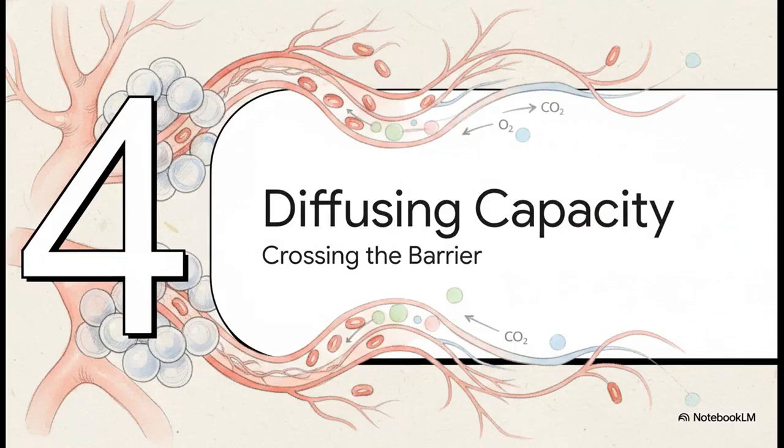Okay, moving right along to section 4, diffusing capacity and DLCO, crossing the barrier. This introduces our final problem. Knowing the lung volumes is awesome, absolutely crucial. But how do we measure how effectively gas is actually crossing the alveolar capillary barrier? For that, we have to turn to our third major category of pulmonary function testing, diffusing capacity.